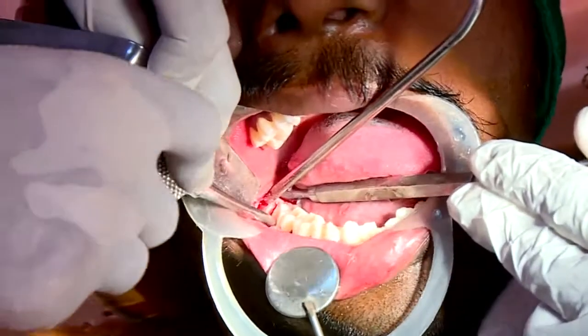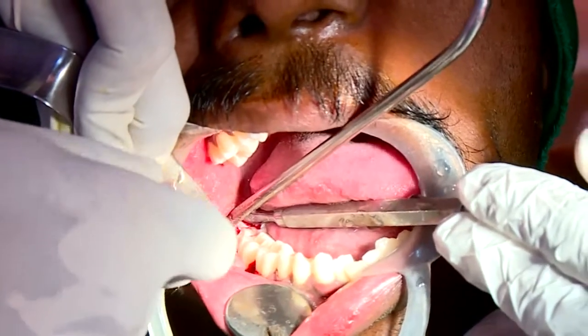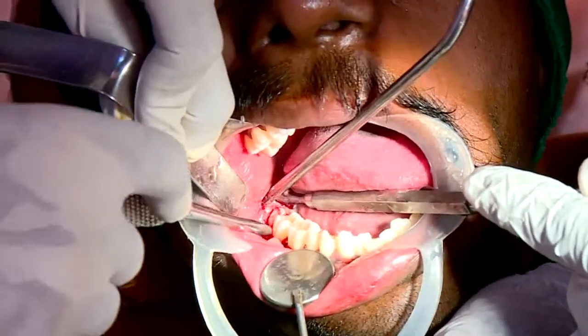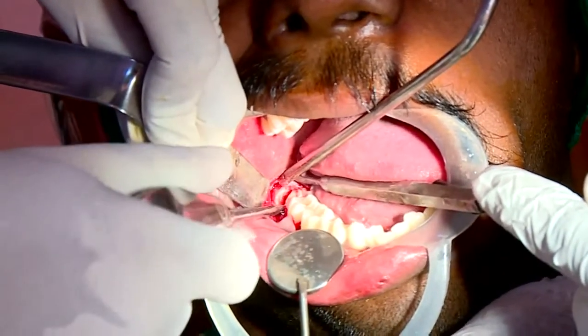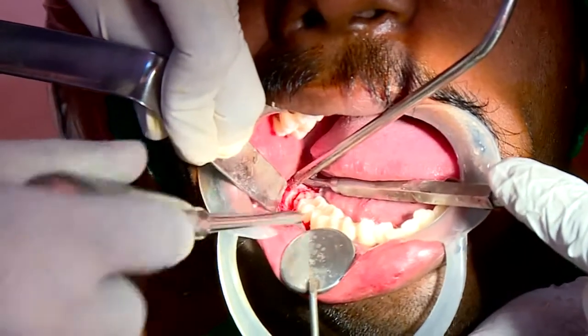Okay? Slowly, naturally, without being in any hurry, take the part of the crown that we have cut. You can feel some amount of movement in the tooth.